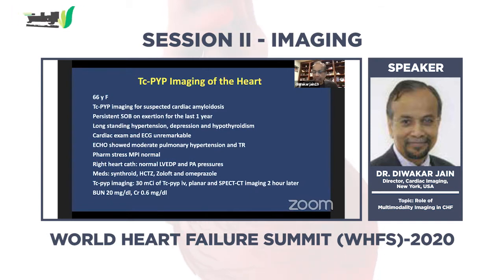I'll show you some cases, and that will be illustrative of how this relatively simple modality works. Now, many of you would recall technetium pyrophosphate imaging is nothing new. This has been in existence for almost 4 decades now, and this was used quite extensively in the past for myocardial infarction imaging, which we don't do right now because other modalities have completely surpassed it. We need to identify myocardial infarction within minutes or as soon as possible, rather than over hours or days, which pyrophosphate would require. But it has found a new application in amyloid imaging.